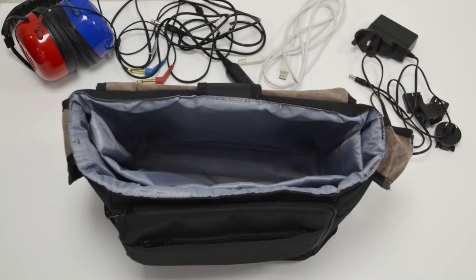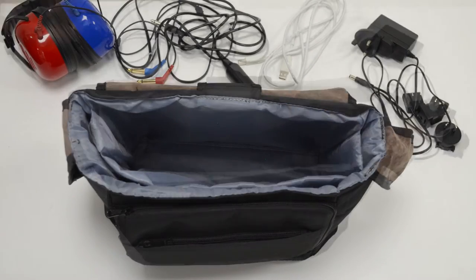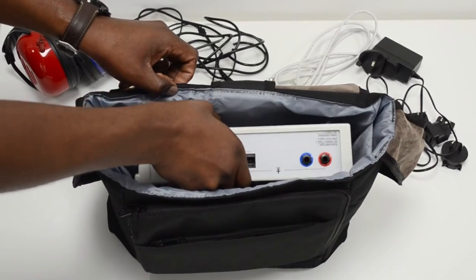First, take your carry case and insert the device using the divider. This will protect it from accidental knocks.